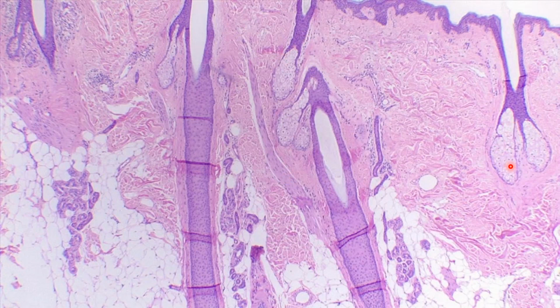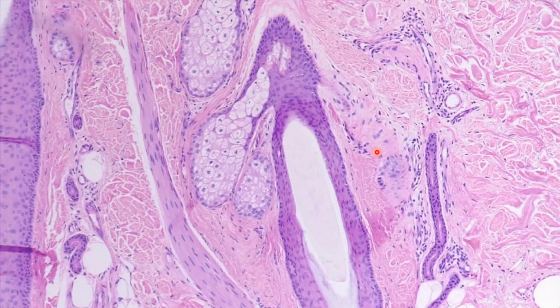So again, random sack of fish eggs connected to the hair, sebaceous gland. Nice pink brush stroke coming across, Erector Pili. Random little squigglies, they look like little tubes, right? That simple cuboidal. Those are going to be those sweat glands, those eccrine and apocrine sweat glands. And again, fat tissue or adipose for that subcutaneous layer.